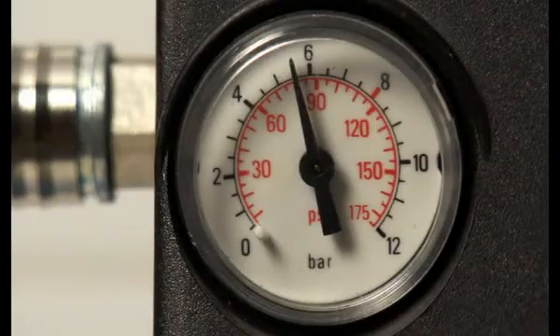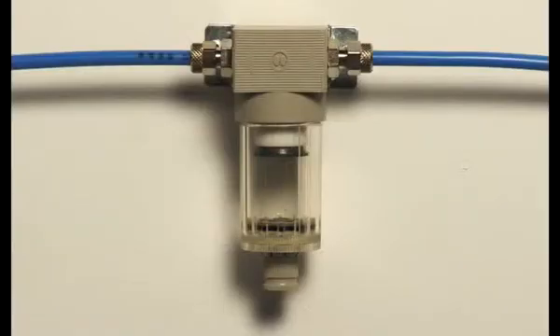Incoming compressed air pressure must be between 5 and 8 bars. Between the compressor and the DAC Universal, mount a 20 micron air filter.